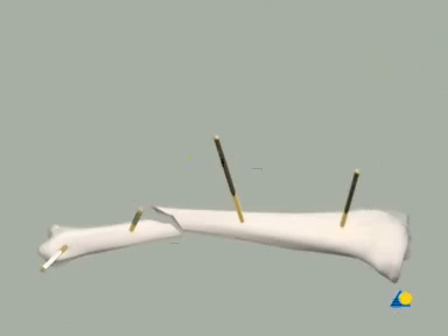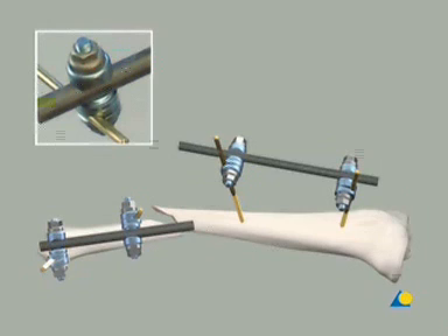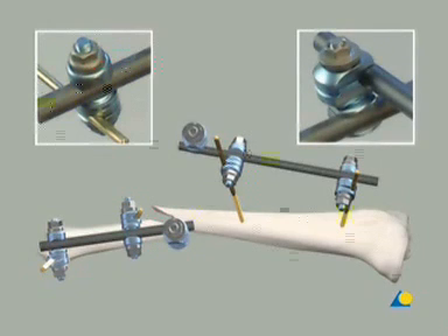For the construction of the modular frame, four large MR-safe open adjustable clamps, two 11 mm diameter carbon fiber rods, two large MR-safe combination clamps, and one additional 11 mm diameter carbon fiber rod are needed.